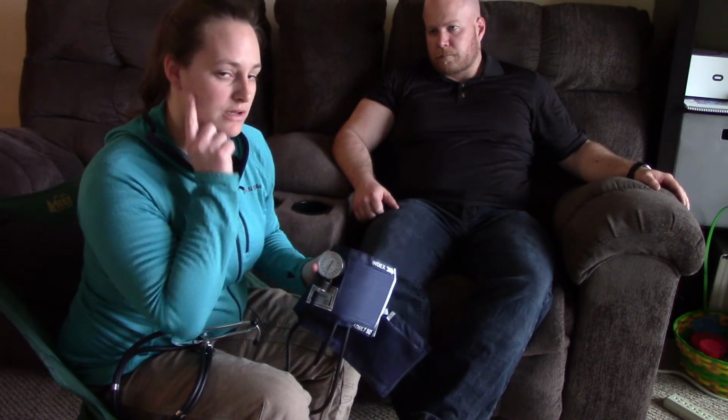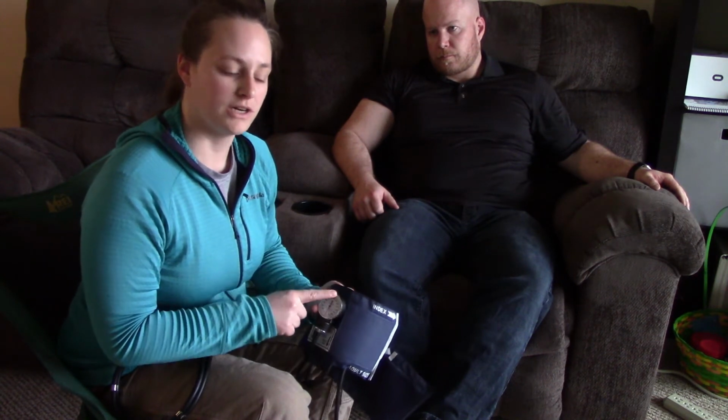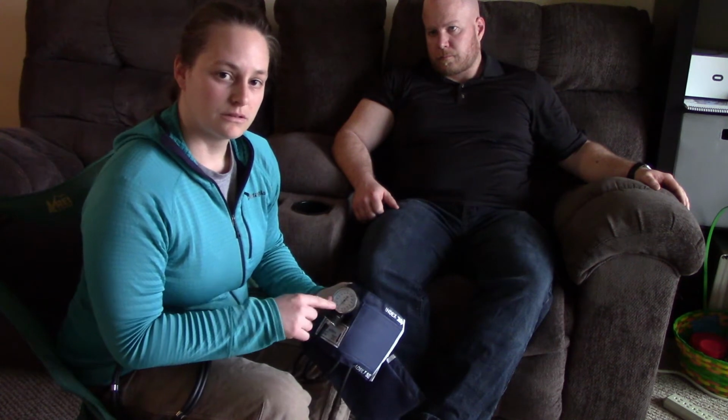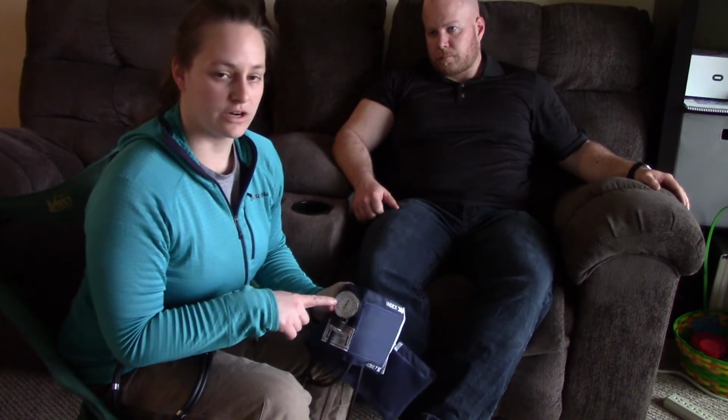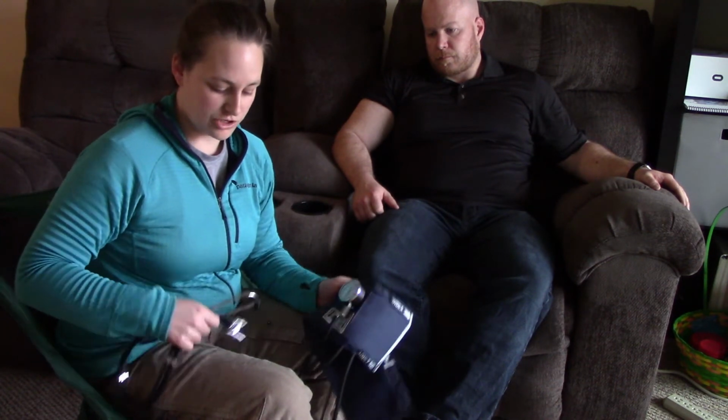So the first heartbeat you hear, you're going to look at the gauge. Wherever the needle's pointing, that's your systolic blood pressure. You'll continue to hear the heartbeat. Once you hear the last heartbeat, you're going to look at your gauge, and wherever the needle's pointing, that's your diastolic blood pressure. And that's how you check a blood pressure by auscultation.